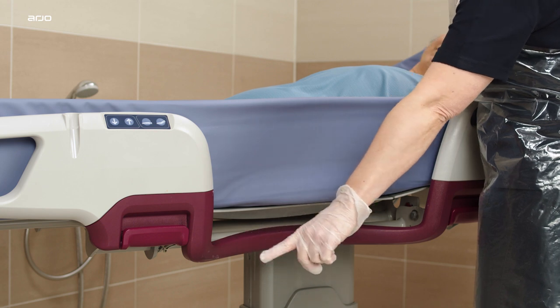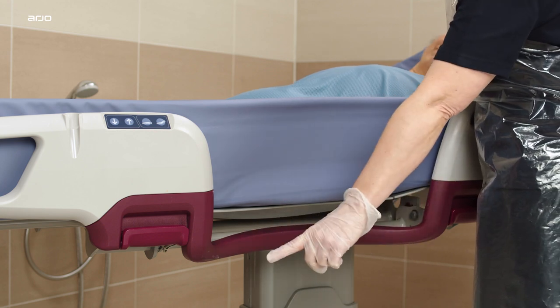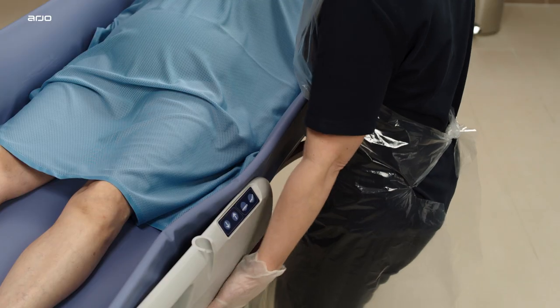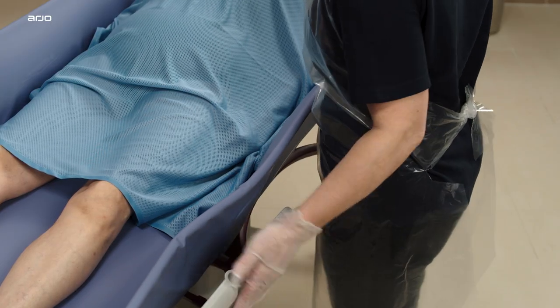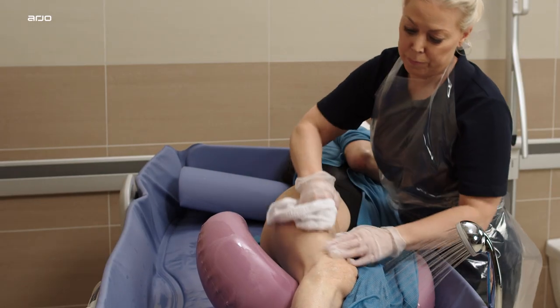The patented ergo access area is located in the middle of each side support. The ergo access areas enable the caregiver to get closer to the resident and maintain a comfortable working posture, thus reducing static physical overload.